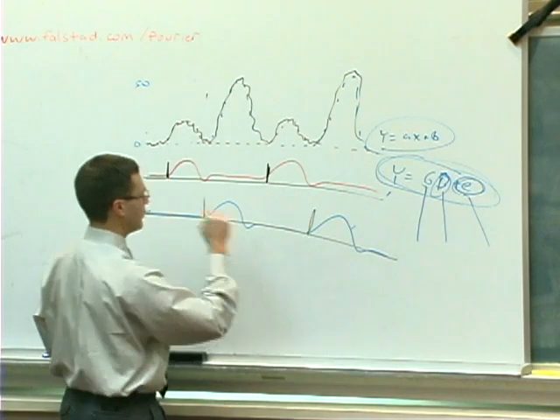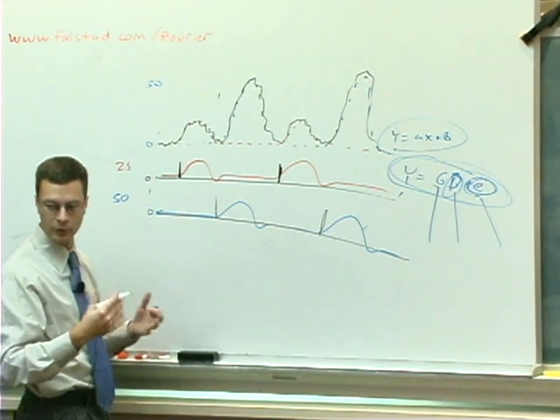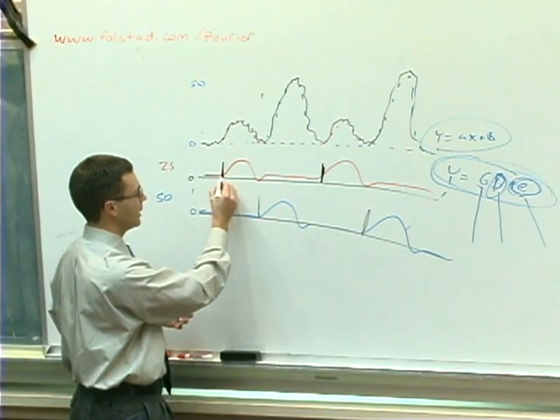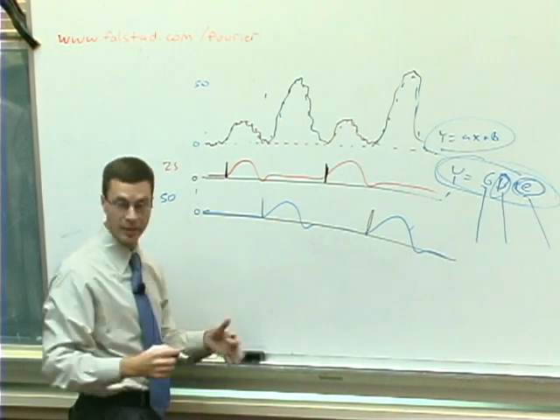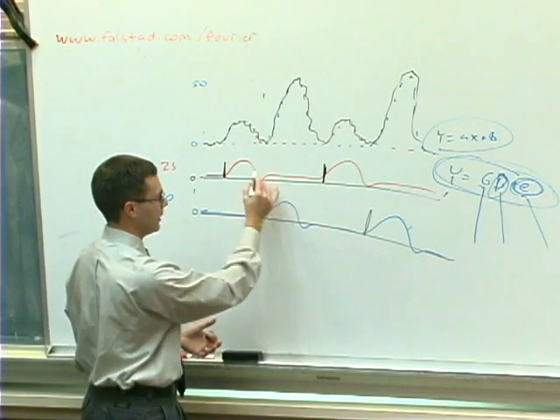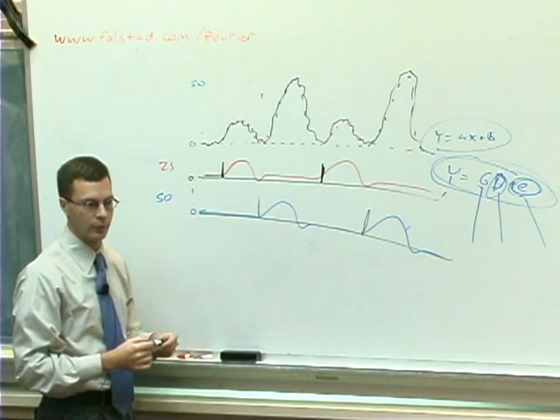And then if you just convolve, right, as we explored yesterday, convolution is multiplication in Fourier space. If you convolve this initial representation of neural activity by the hemodynamic response function, what you get is this line that's in red and in blue. And then these things are what serve as the predictors in your model.